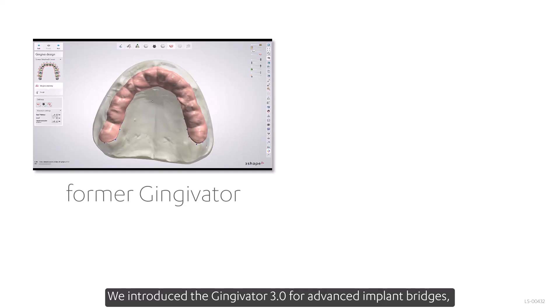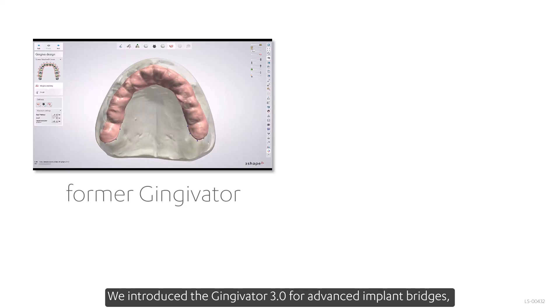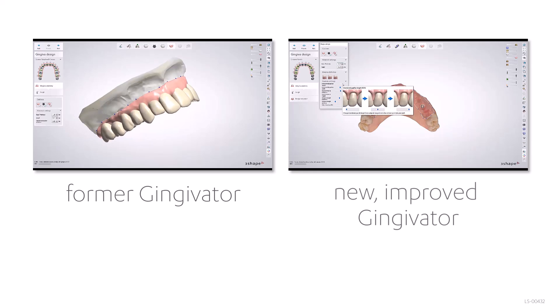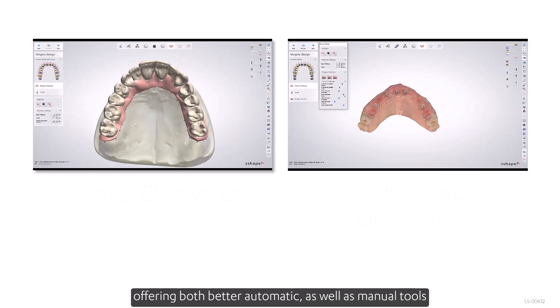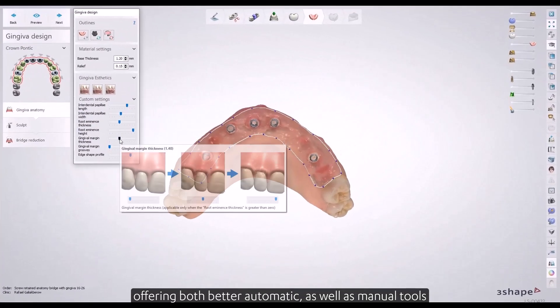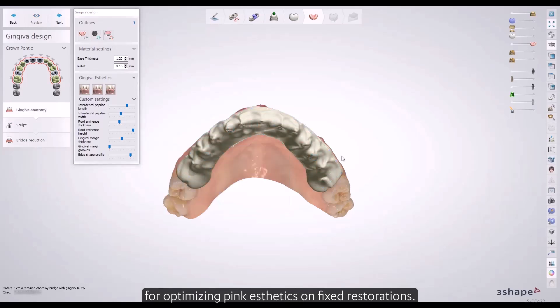We introduced the Gingivator 3.0 for advanced implant bridges, offering both better automatic and manual tools for optimizing pink aesthetics on fixed restorations.